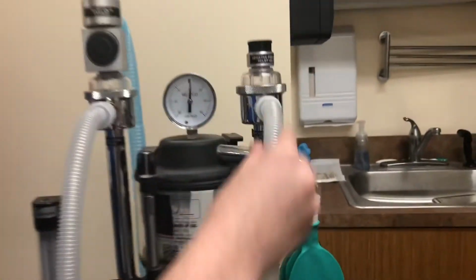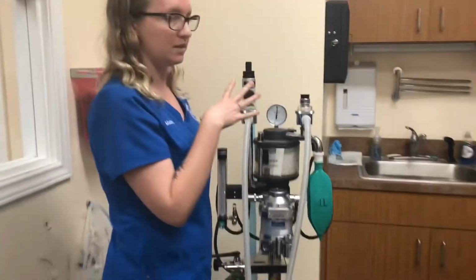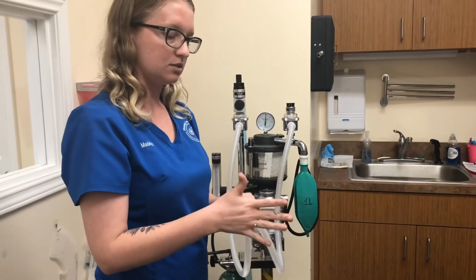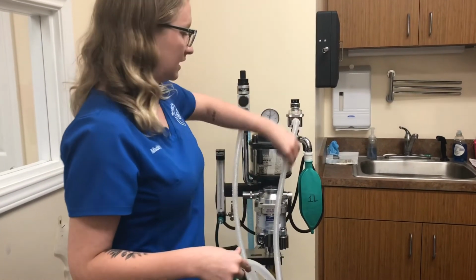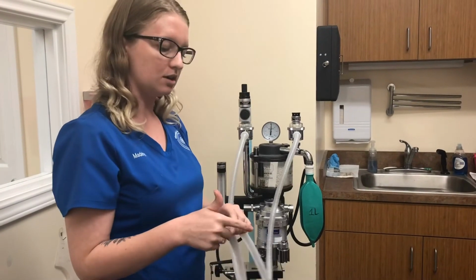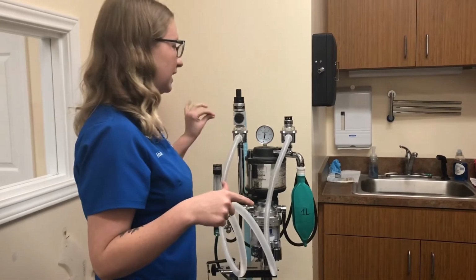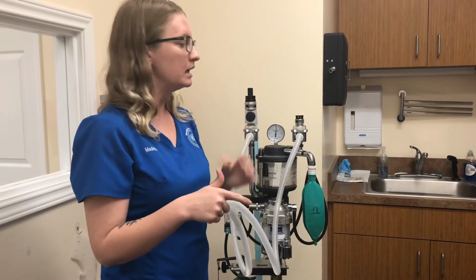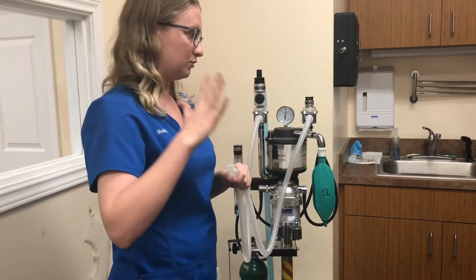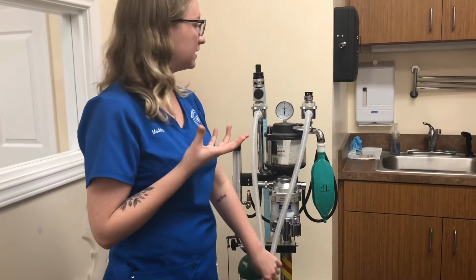So we have an inspiratory valve and an expiratory valve. This is a rebreathing machine, so how it works is when you hook your patient up, whether it's to an ET tube or a mask, they inhale through this tube and exhale through this tube. Some advantages to this are preventing hypothermia because the breath that they're breathing out is warming the breath that they're taking in. A disadvantage is if you have a small patient, it takes more effort to breathe through it. In that case, you would want to use a non-rebreathing system.